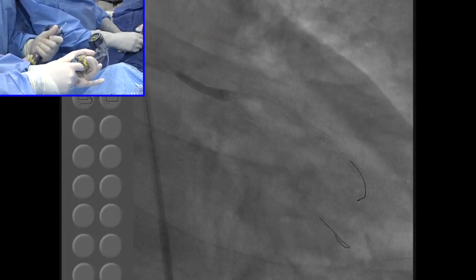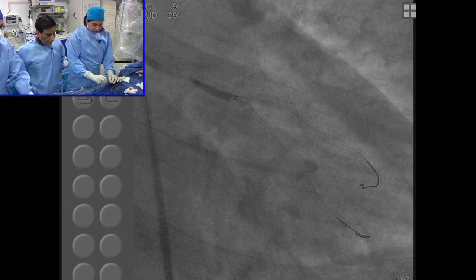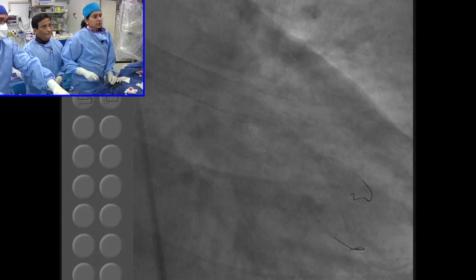Okay. Good, negative. Down. All right, so we are done. We see the main, how things are, and if it looks good, we come to the conclusion.